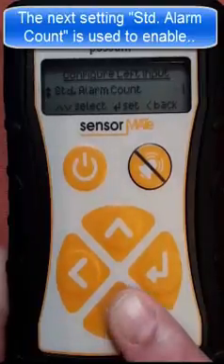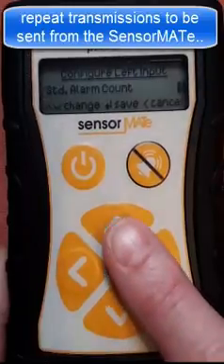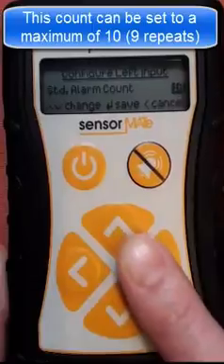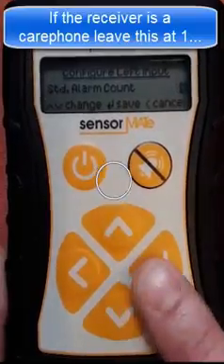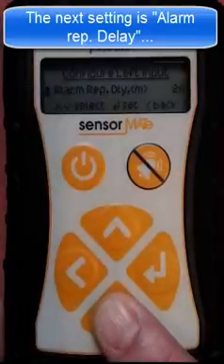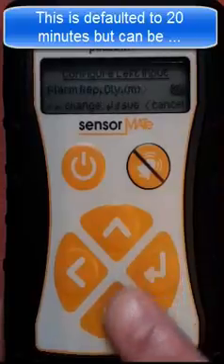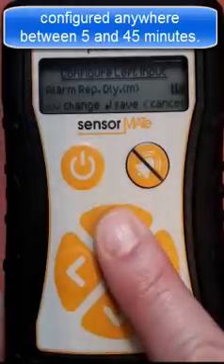The next setting, standard alarm count, is used to enable repeat transmissions to be sent from the Sensormate unit. This count can be set to a maximum of 10 or 9 repeats. If the receiver is a care phone, it is recommended that you leave this at 1 to prevent unnecessary repeat alarms presenting to the alarm response centre. The next setting, alarm repeat delay, sets the periodicity between the alarms that are sent. This is defaulted to 20 minutes but can be adjusted anywhere between 5 and 45 minutes.